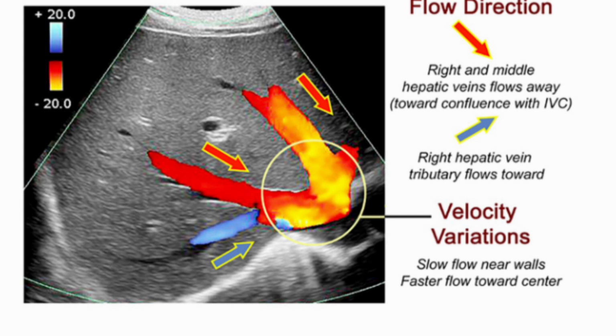We look for blood flow within veins and arteries to check if there's any sort of plaque buildup, if there are clots. We can also use what is known as twinkle artifact to look for stones in gallbladders, kidneys, and there are many other uses for Doppler in ultrasound as well.